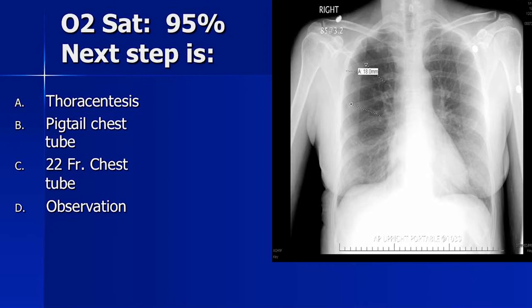As you're answering this question, I'll mention that it's relatively uncommon to see a pneumothorax. More commonly, what we will see will be a hydrothorax or a hemothorax. So more commonly, we'll see blunting of the angle, perhaps an effusion here, and that would be the more common situation as opposed to a pneumothorax, which is about 5 or 6 years since I've seen a pneumothorax.